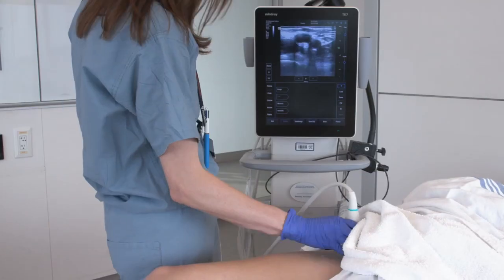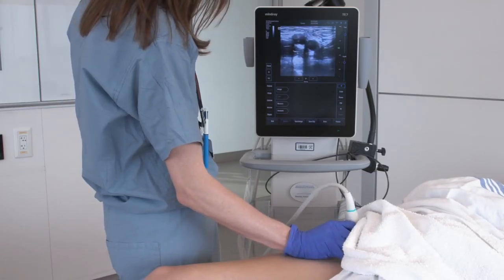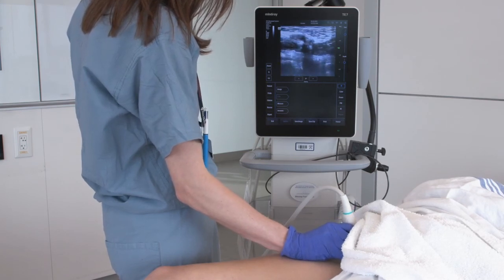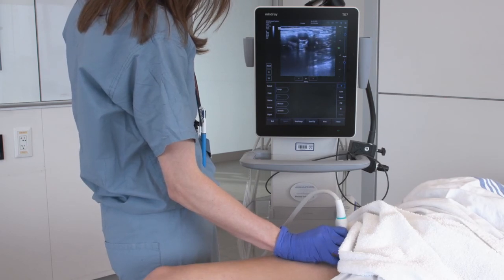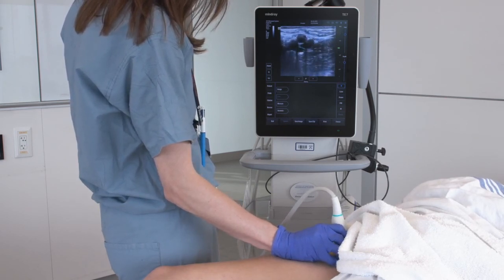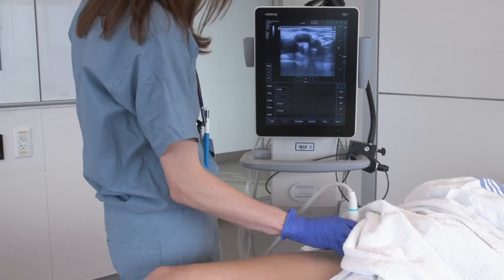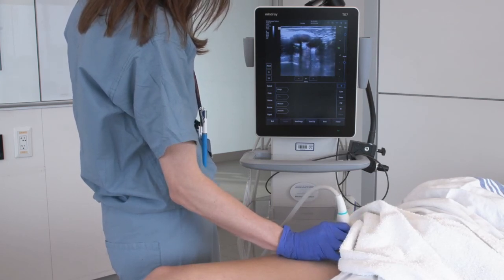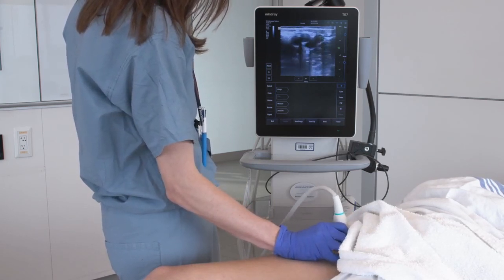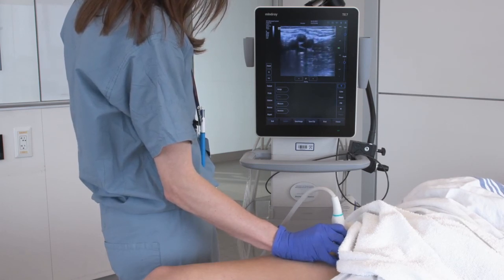Now that you know the basics of the vascular anatomy, next we will review how to assess the deep veins for the presence of thrombus. Starting with a view of the femoral vein and artery, gently compress the vessels until you see mild deformation of the artery, at which point the two walls of the vein should be completely collapsed and touching each other. This is normal and indicates that there is no clot in the area you're examining. Briskly compress every centimeter, especially at branch points, applying pressure perpendicular to the vessels with the vessels centered in your screen, moving proximal to distal.